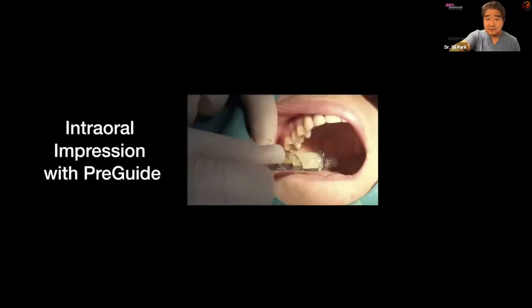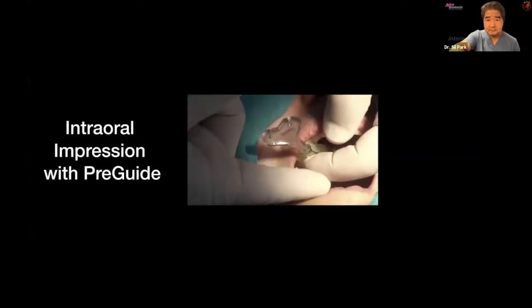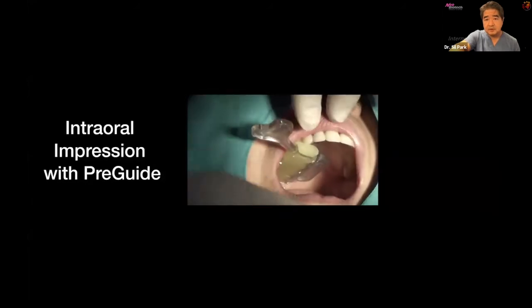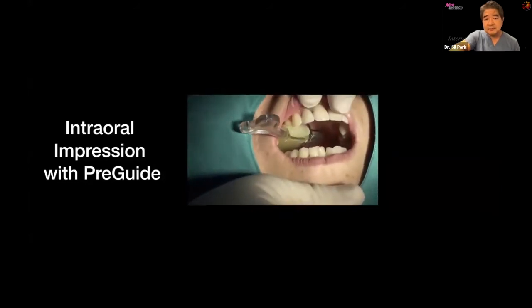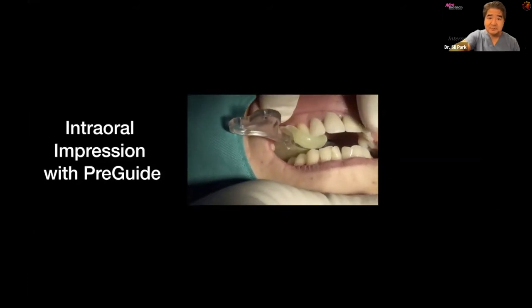So let's look at how to use this. You gently put it in, and then let the patient bite in the CR position gently until it's fully down. Pretty much that's it. That is your first step.